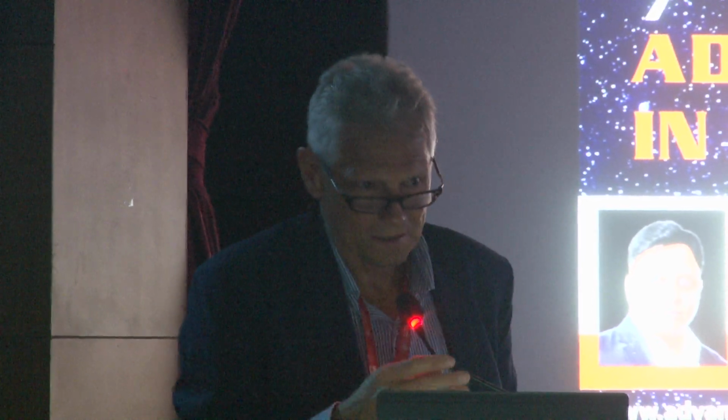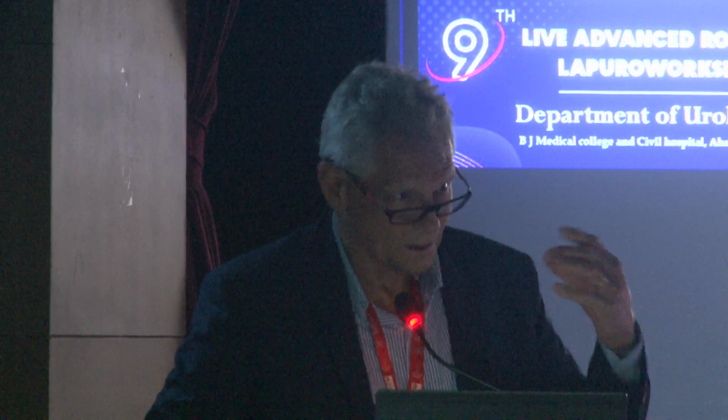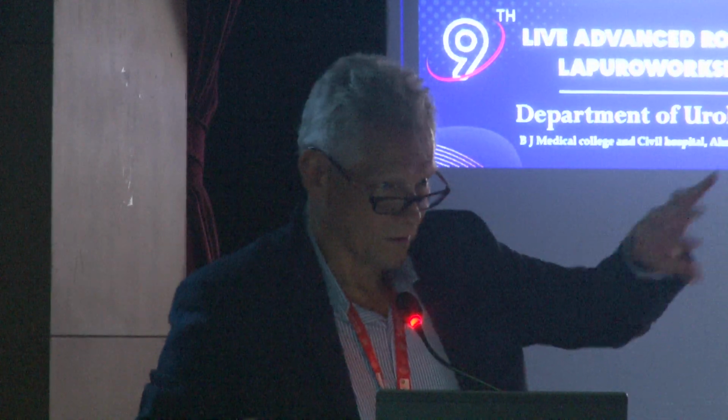No, with the robotic approach, I'm doing transperitoneal because I play with six ports, and I teach this in the university hospital, and sometimes in the pre-peritoneal space they are lost. They are looking for their instruments, so I don't want to have any injury of the bowel and so on. So for the university hospital with the robot, I'm doing transperitoneal, but I'm just detaching the lateral part of the bladder.